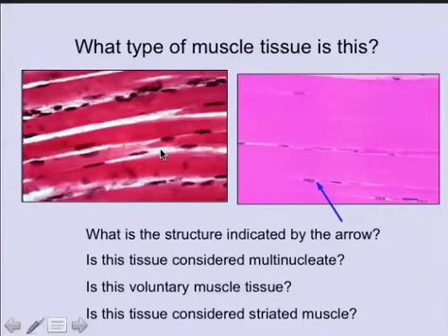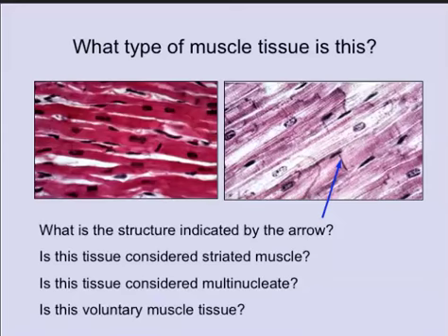Now we move on to a different type of muscle tissue. And I'll give you 30 seconds this time to figure out what kind of muscle tissue this is.